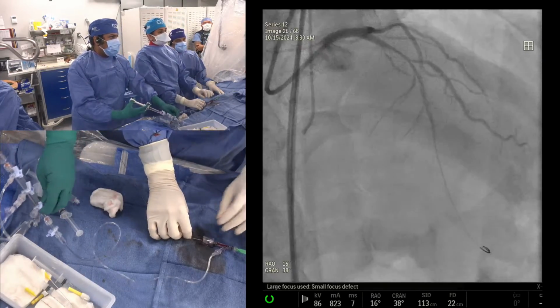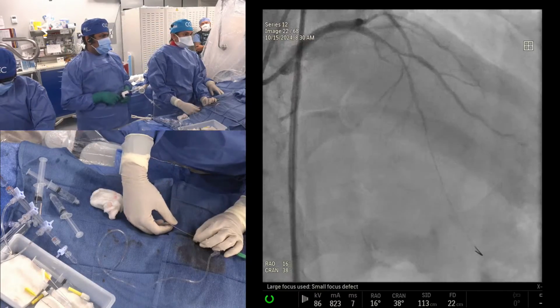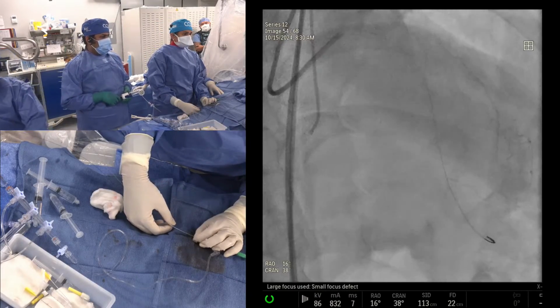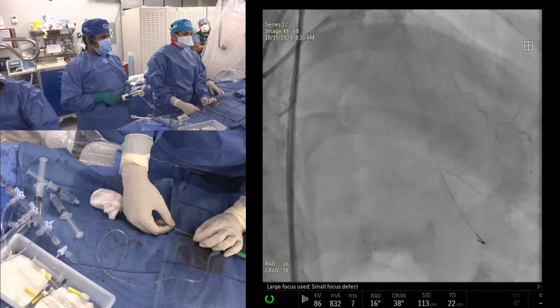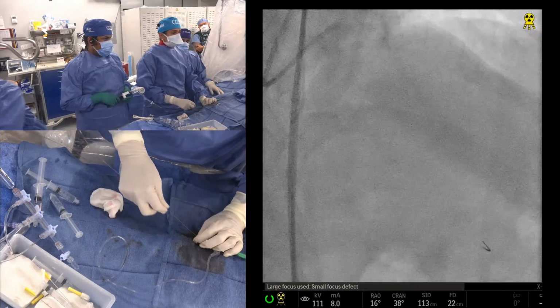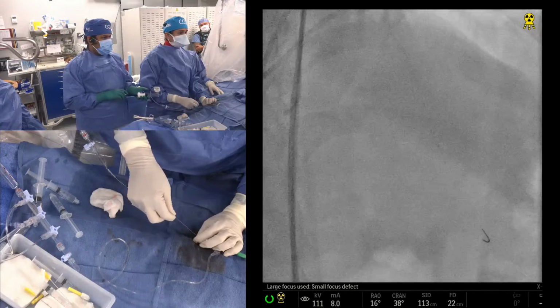Dilatation is making great progress. When the balloon was giving trouble, I thought it was laser time. Dilate with the same balloon a little bit more. Bad, very diffuse disease. I'm trying not to over-balloon. Low pressure, that's fine. Okay, go up here.